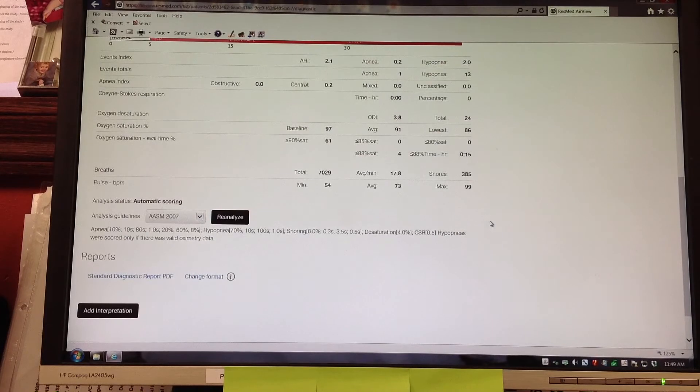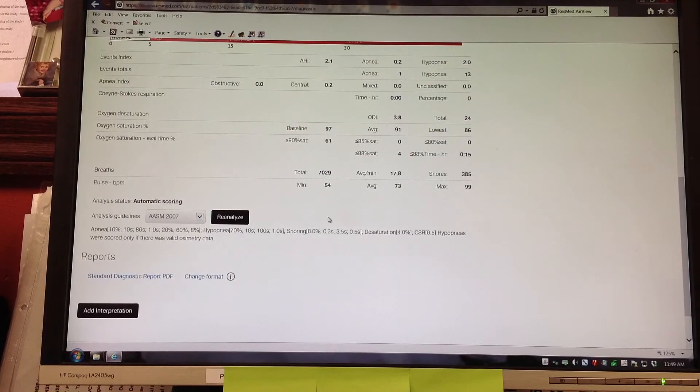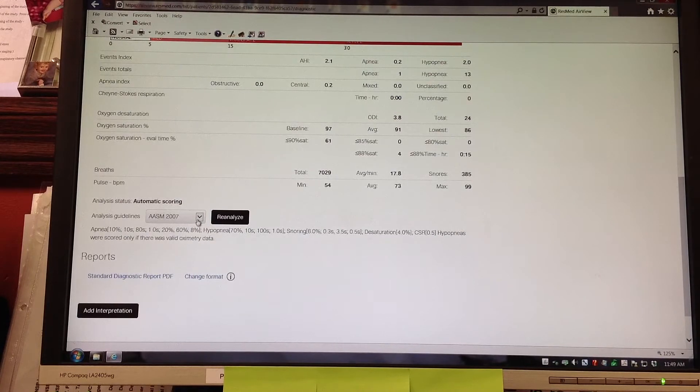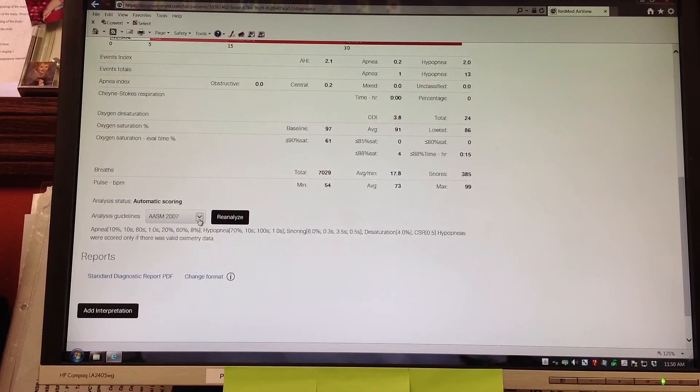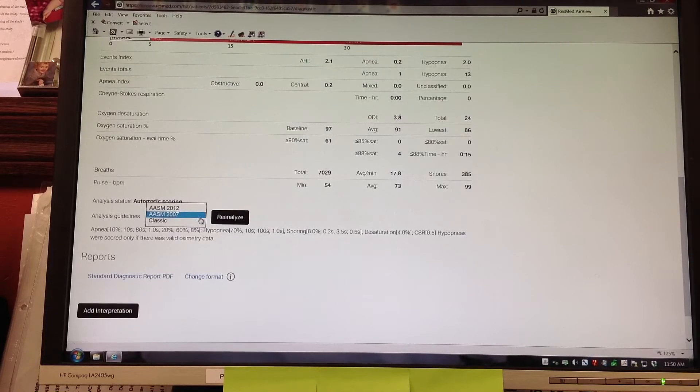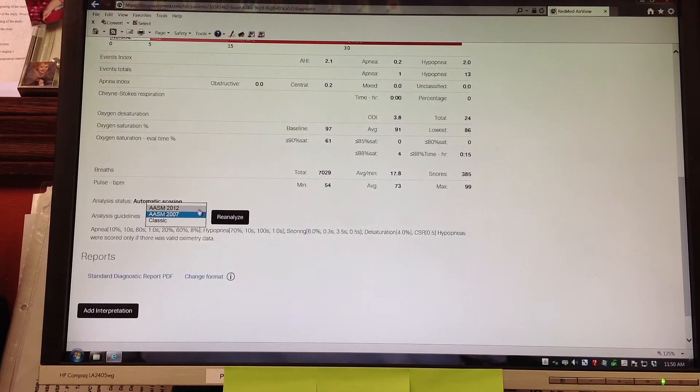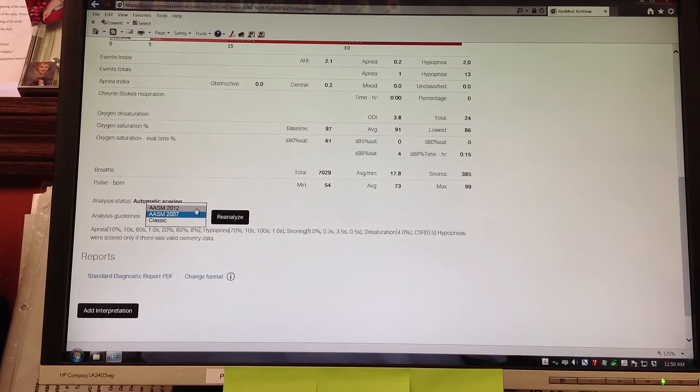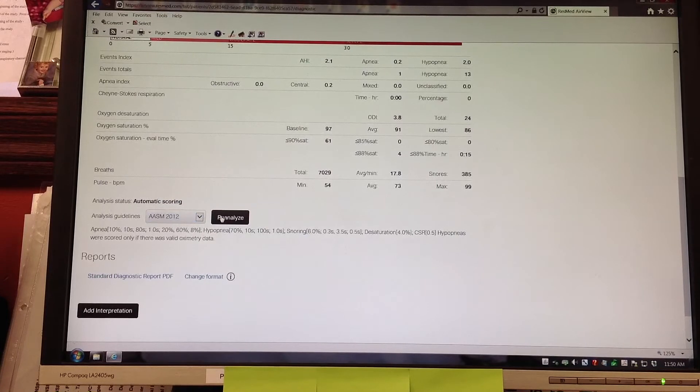Teresa is scrolling down. There is an area where it says analysis guidelines. It says AASM 2007. We are going to click on there and pick AASM 2012 and click reanalyze.